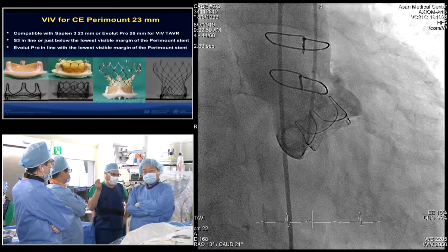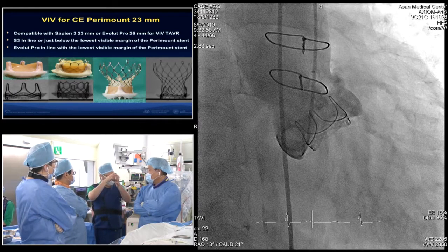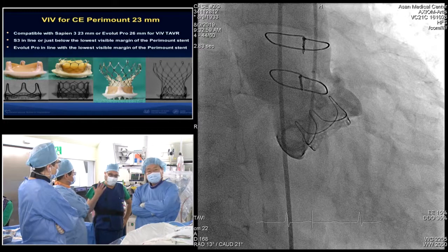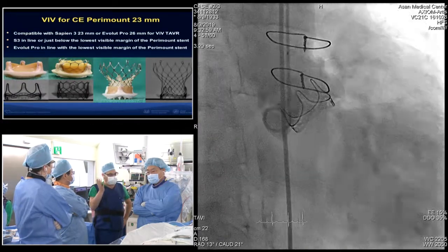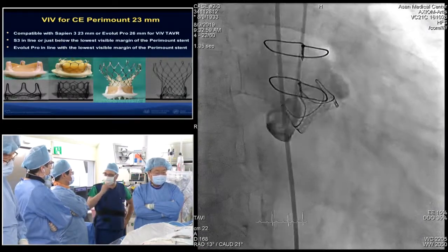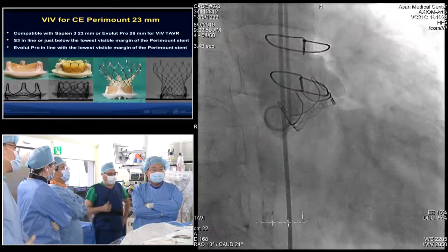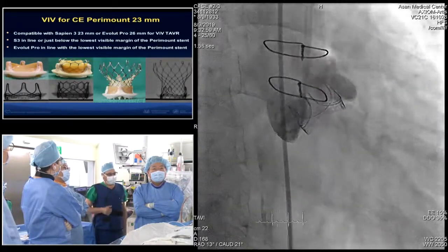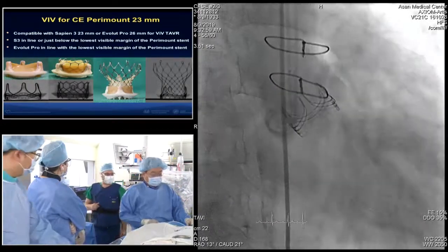We haven't seen any problems with post-dilating the S3 aggressively. We have seen one case with a core valve where the balloon got a little bit too high up to where it was the constrained part of the core valve, and that did tear the core valve, and we had to put an extra valve in in that case. So it can happen. It's certainly safer from damaging the valve to fracture first. The problem is that if you damage the existing surgical valve, you may have to rush because they may develop acute severe aortic regurgitation, and then you're moving quickly. So you have to balance those two. We have not had problems, except for that one case with the core valve, which was our own case, of damaging the valve. So that's not been an issue, but it can be an issue, and it's certainly something to think about.